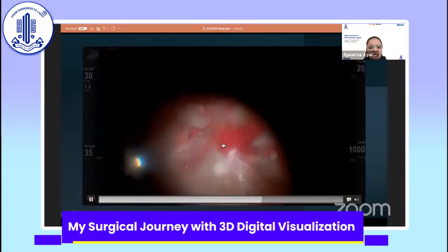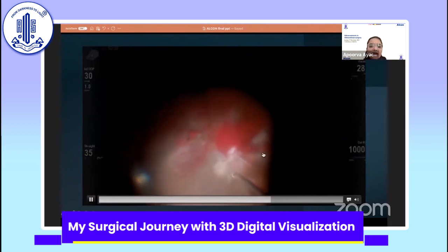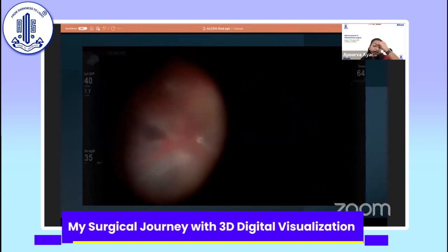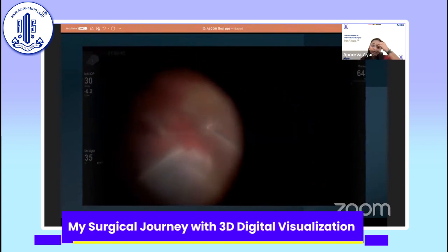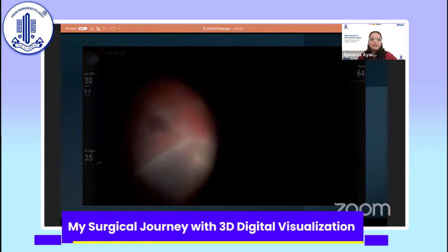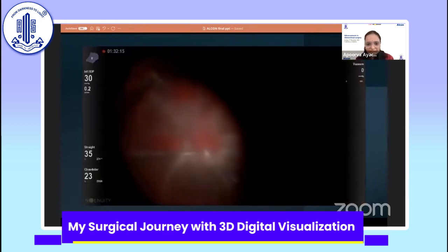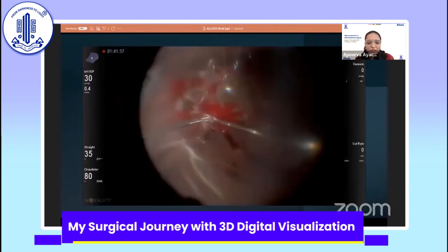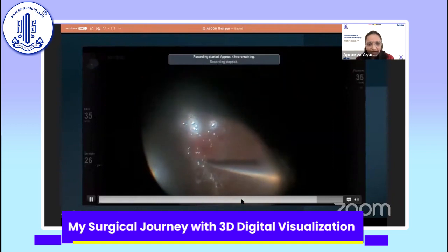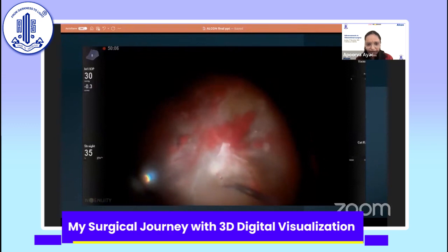So one thing is we tend to do the membrane surgery, and as we are proceeding with the membrane surgery, we forget or we are not concentrating on the oozers that are there. I think it's good advice to take a small break and just see where all it is oozing. Use our diathermy, go in and diathermize the bleeders. Now, unfortunately, we don't have a 27 gauge scissors, so I have made a separate 25 gauge port and used 25 gauge horizontal scissors to do a bimanual surgery.